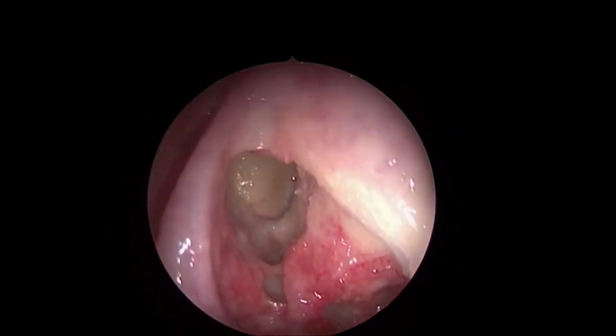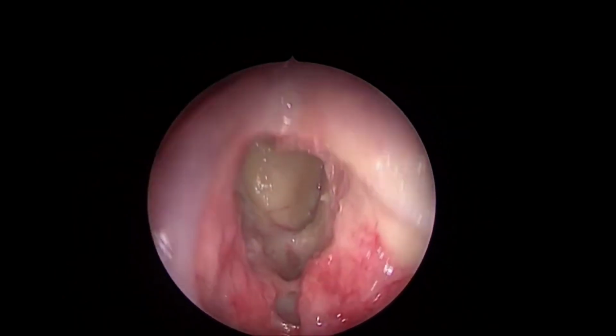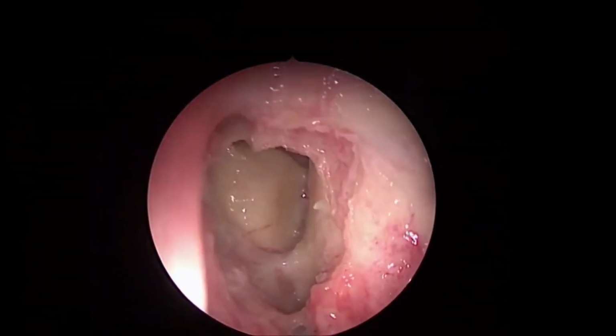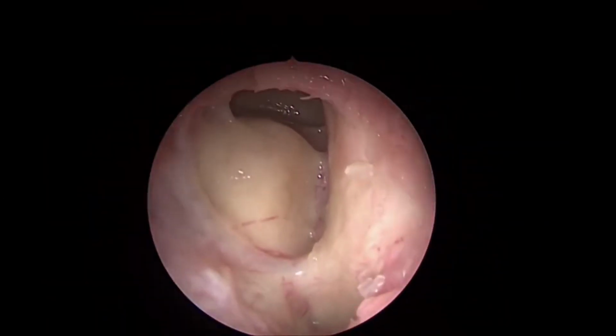Not only for sinusitis now, this approach is being more and more used for other skull-base pathologies, to deal with CSF leaks.